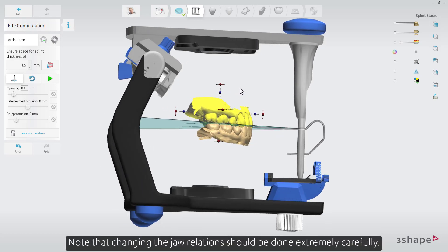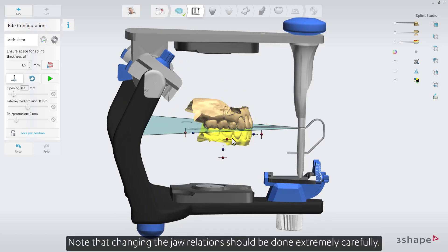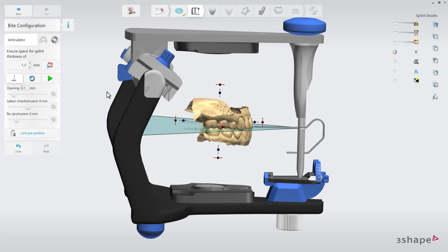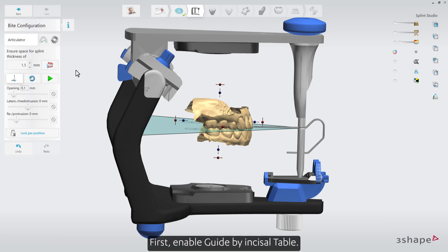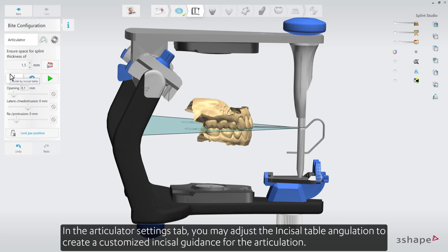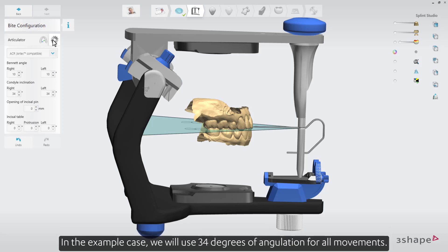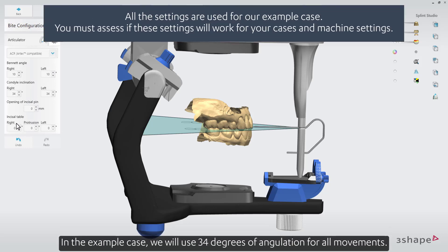Note that changing the jaw relations should be done extremely carefully. In this case, we will adjust the virtual articulator settings to help produce the canine guidance ramps for the splint. First, enable Guide by incisal table. In the Articulator Settings tab, you may adjust the incisal table angulation to create a customized incisal guidance for the articulation. In the example case, we will use 34 degrees of angulation for all movements.